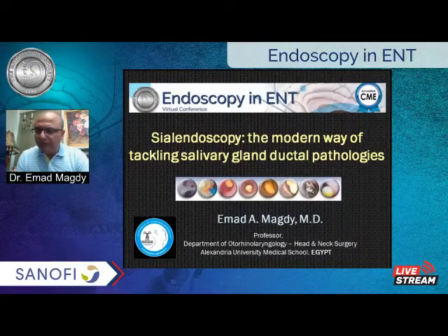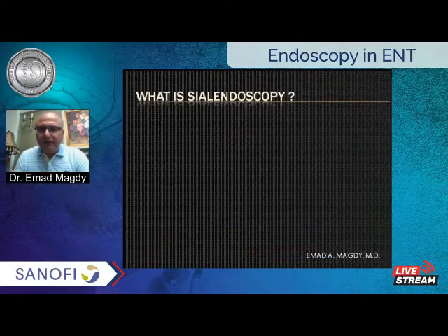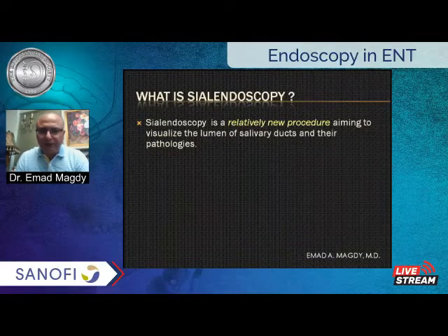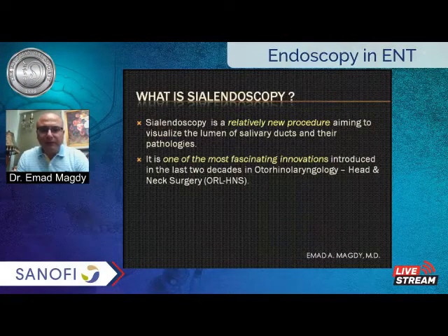Today, I would be talking about Sialendoscopy that, as you probably know, was introduced in Egypt and has been regularly practiced in Alexandria for almost 10 years now. Sialendoscopy is a relatively new procedure aiming to visualize the lumen of salivary ducts and their pathologies. It is one of the most fascinating innovations introduced in the last 2 decades in our field.